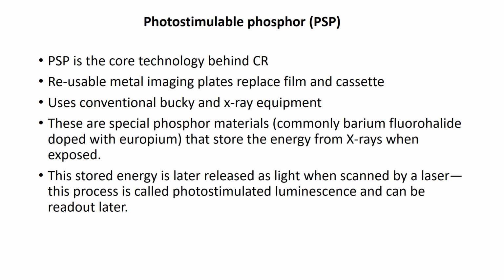The first component is the photostimulable phosphor, also called PSP. This is the core technology behind computed radiography. Under this PSP we use a reusable metal imaging plate, which replaces the conventional film and cassettes, and the conventional bucky and X-ray equipment can be used in this system.